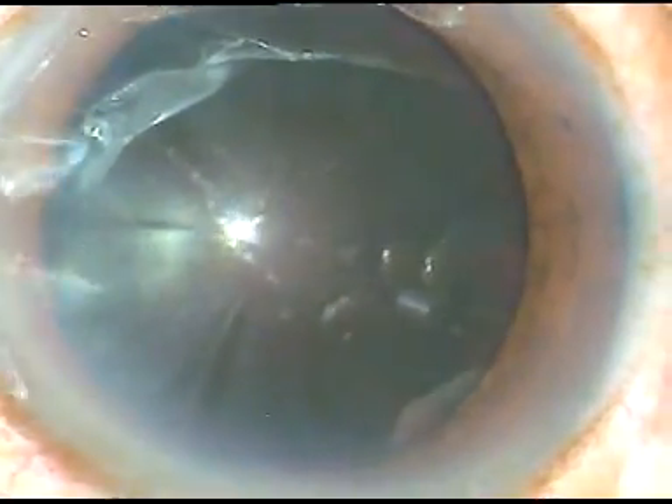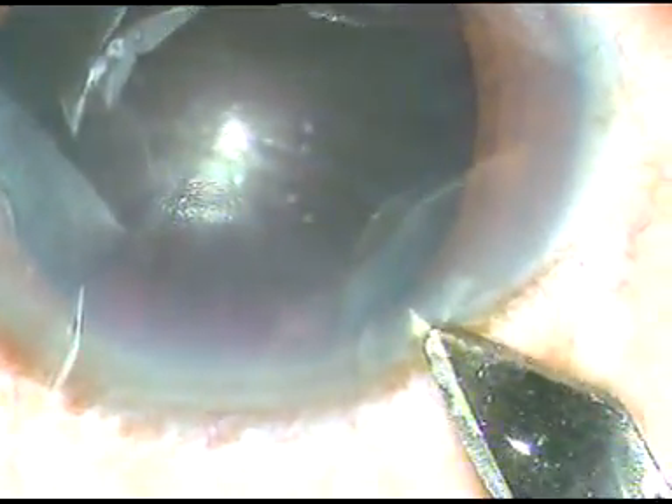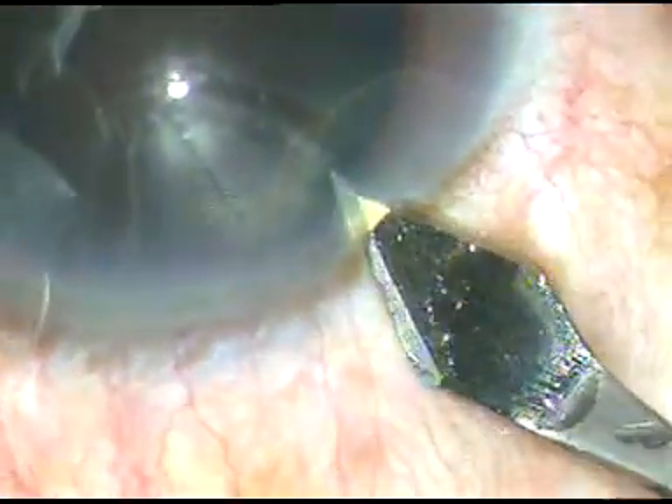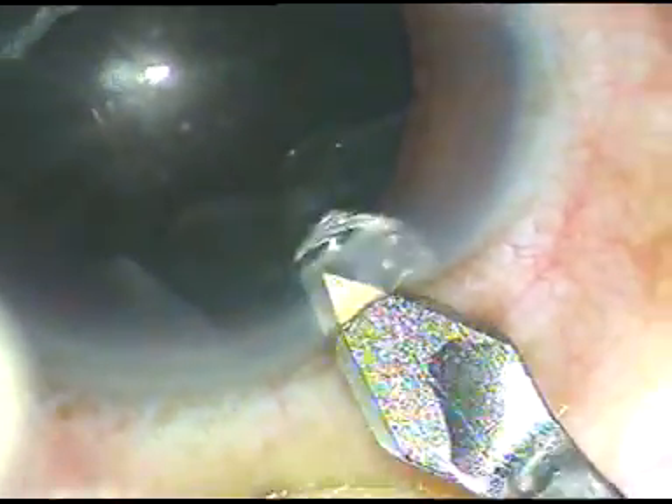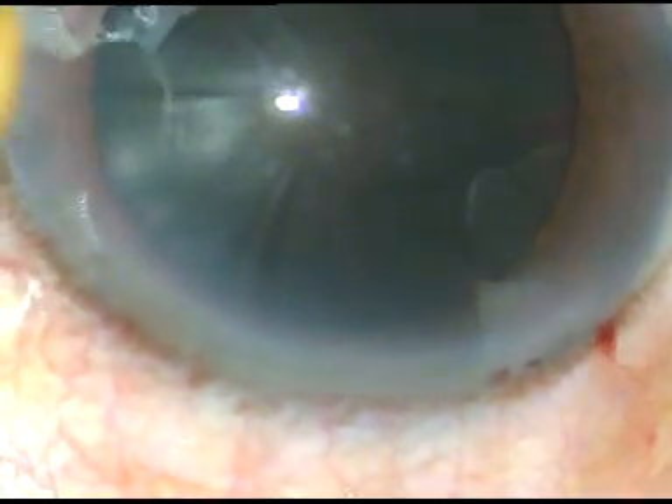Dear colleagues, this is a very hard cataract. You can see the black appearance of the cataract. Nuclear sclerosis in this case will be about grade 6. I have taken up this case for surgery. Let us watch the surgical steps.